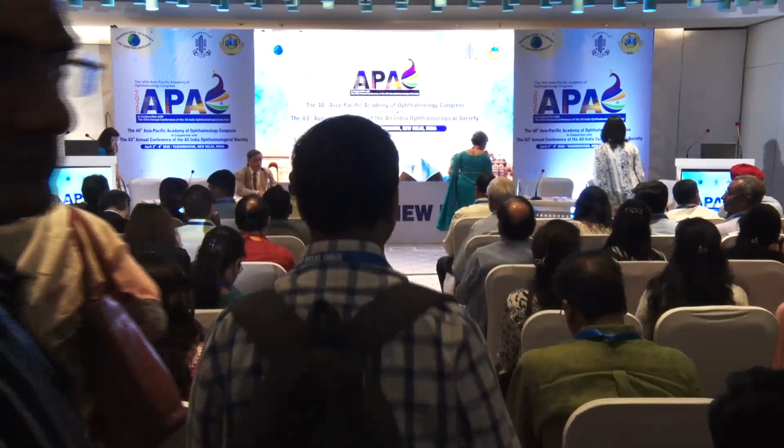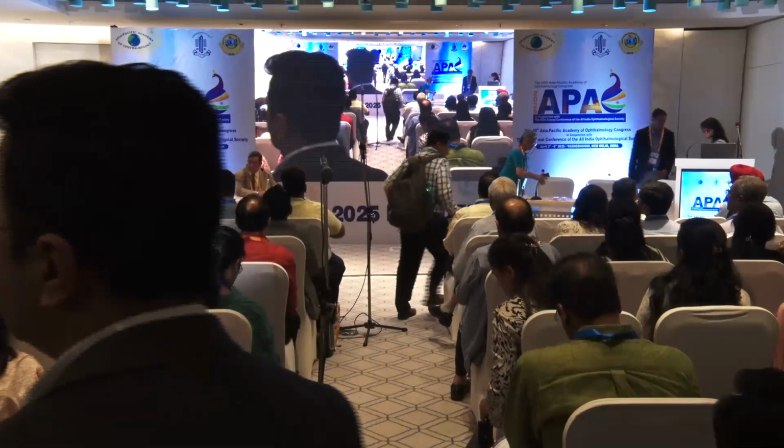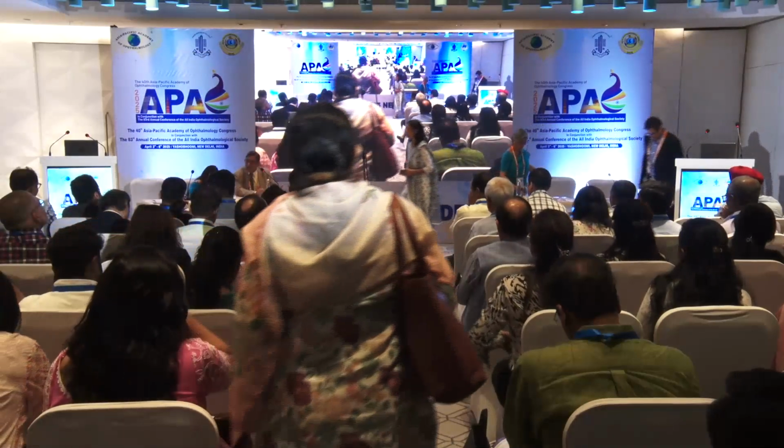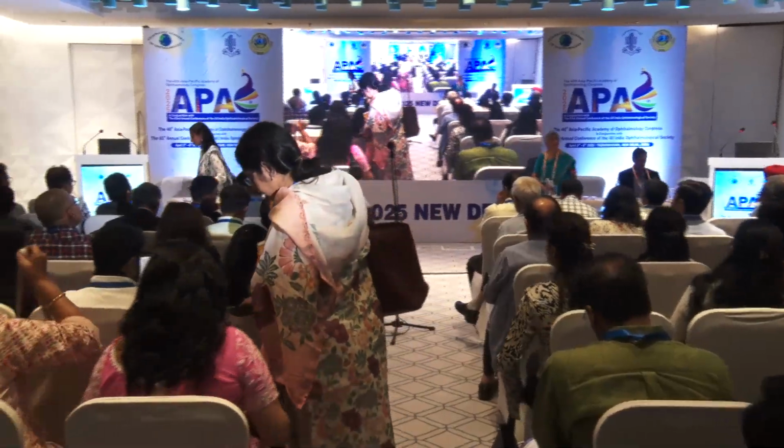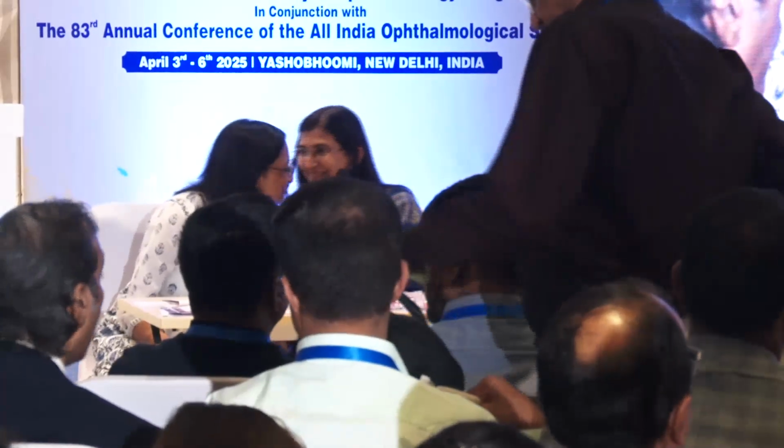Welcome to this course on OCT for all. When I say comprehensive ophthalmologist, I mean all of us. Whatever you may be doing, OCT is an instrument for you. It's an instrument which is versatile enough that not only is this the backbone of diagnosis for the retina surgeon, today an anterior segment surgeon can need it as much as we do, and not only the anterior segment surgeon, but even the glaucoma specialist needs it to do a good job of his management of glaucoma.